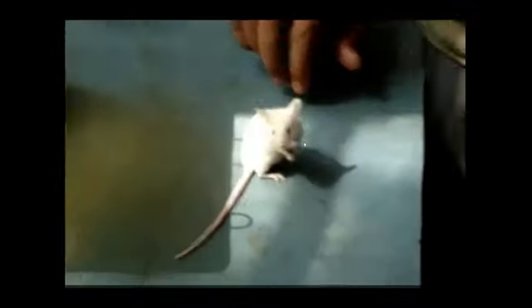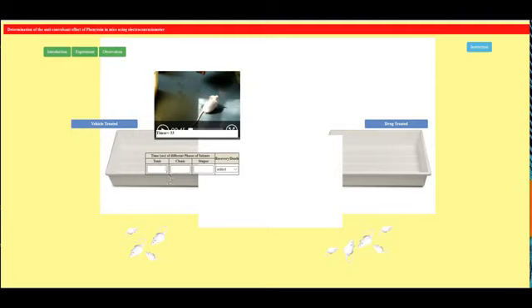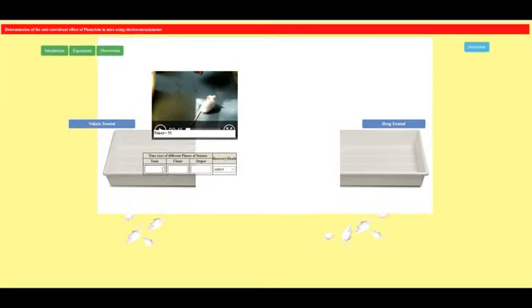Now it is also alive. So now I am going to write the readings. The shivering took about 7 seconds, then rapid jerking for 8 seconds, and the stupor movement for 30 seconds, and it is recovered.